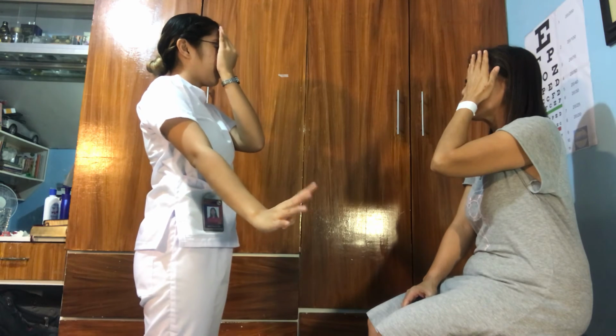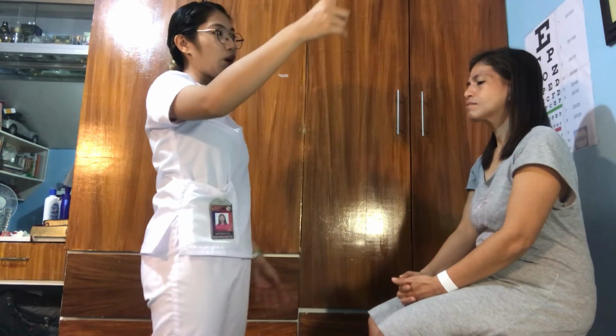3. Okay, so also within the left eye the patient has mistakenly answered 2 of the questions, which is right here she answered 3, which should instead be 4, and then right here she answered 1 instead of 3. So therefore, there might be a problem with the peripheral visual fields of our patient. So after that, we need to record all of those because all of those should be assessed further by the optometrist or doctor that is a specialist in the eye.